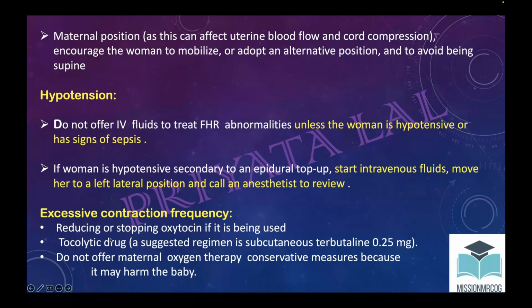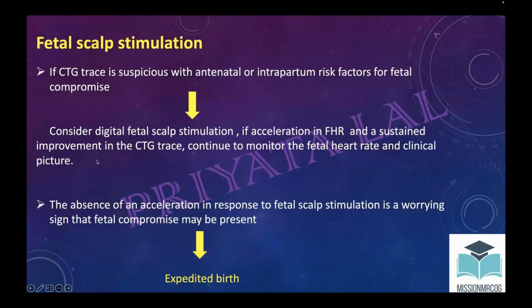In the previous guideline also, for any trouble in the intrapartum period, they were not offering oxygen. For fetal scalp stimulation: if the CTG is suspicious and some risk factors are there, do digital fetal scalp stimulation.